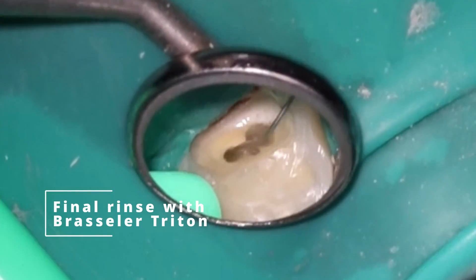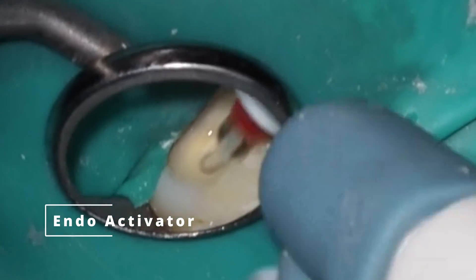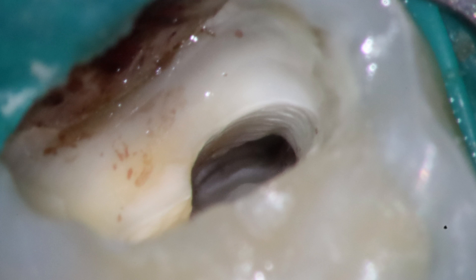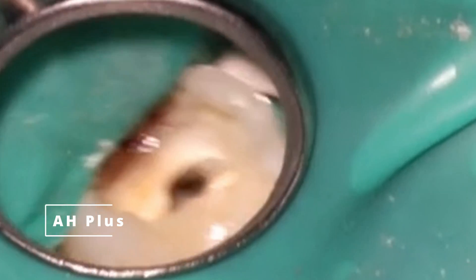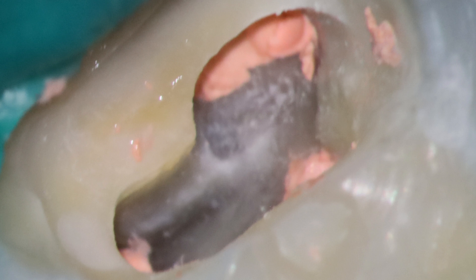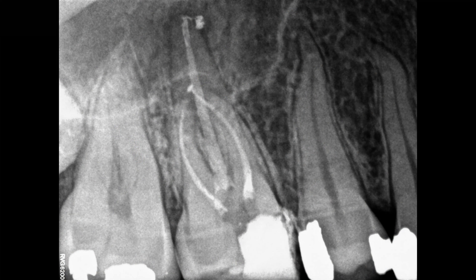I'm going to show the rest of the case here sped up a little bit, since you've seen this before. We're going to use the squirt fill technique like we have in the past — go back with the 20K file to patency and squirt fill like we would normally using the B&L products. After everything looks good, hit it with the Pac-Mac to make sure everything looks solid. And here is what it looks like: you can see those MBs pretty much joined. When we look at the final image, there's really not any definition between the MB1 and MB2. However, we were able to keep things really nice and conservative — even though troughing can sometimes remove a ton of tooth structure and weaken the tooth, in this one we were able to keep things so nice and small and tiny it shouldn't be an issue whatsoever.